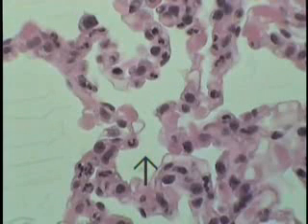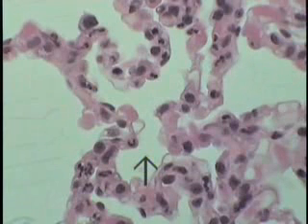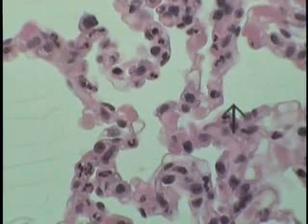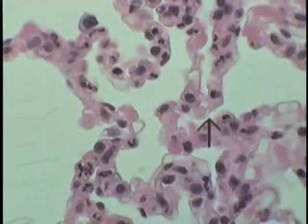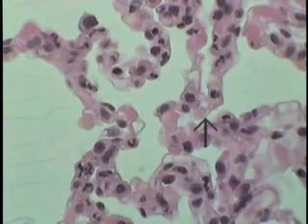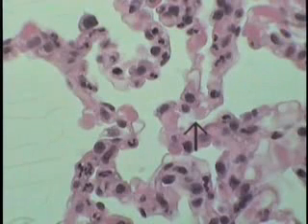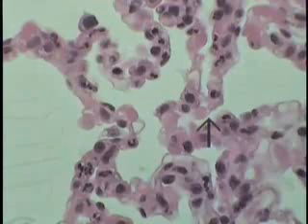An additional region of lung shown at increased magnification, showing several collapsed alveoli and illustrating some of the features of the epithelial lining. Once again, this is the lumen of a collapsed alveolus shown here, and once again, just to drive home the point of the thinness of this epithelial lining and its association with the endothelium. So this is that very thin strand right at the tip of the pointer and the underlying erythrocyte. A little gap in between, that's light.